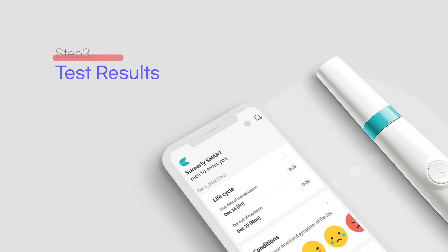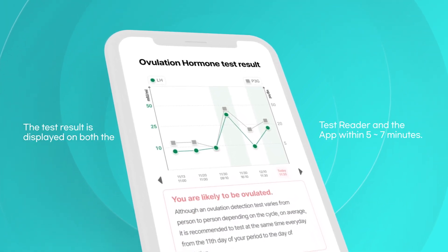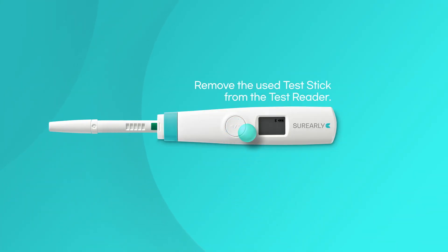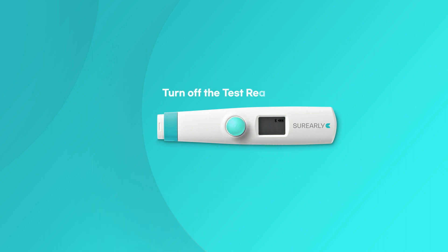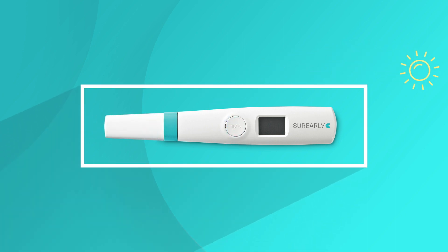Step 3, test results. You can find the test result both on the test reader display or on the app after 5 to 7 minutes. After checking the result, press the power button lightly to remove the test stick. Press and hold the power button for 5 seconds to turn off the test reader. Close the cap and store the reader away from direct sunlight, moisture, and heat.